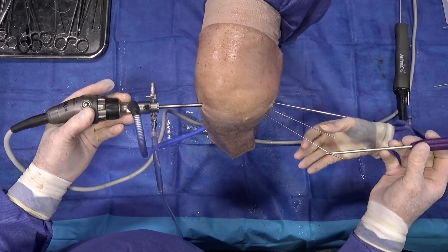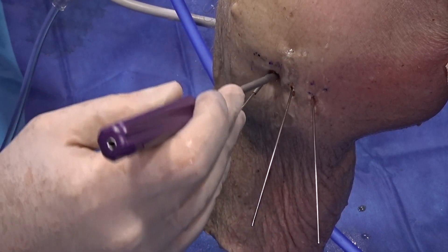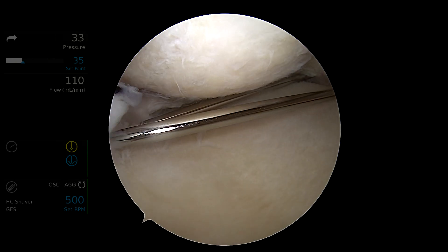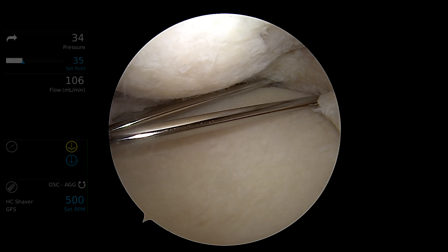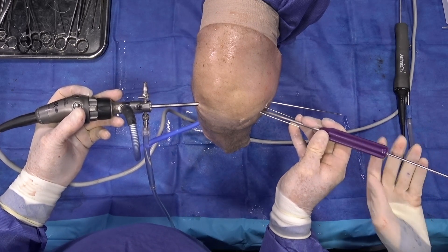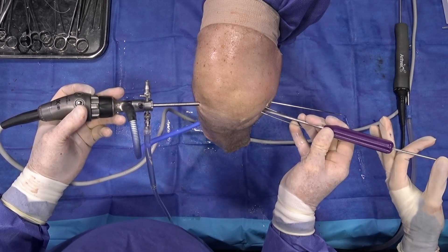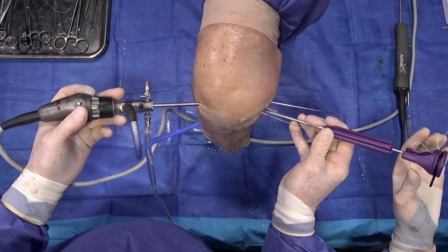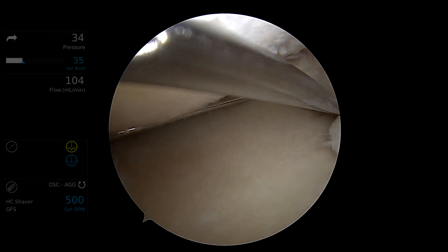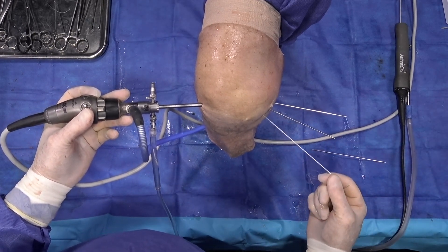The guide is placed over the guide pin, setting us at the appropriate angle to be three millimeters below the articular surface of the tibial articular cartilage. We confirm the guide wire is pointing at the tibial spine and parallel to the articular surface. The guide is advanced down to the tibial metaphysis and the assistant drills. The guide remains in place and the knotless suture tack is then placed and impacted into position. It's helpful to remove the guide pin before taking the guide out due to the divergent angle — and there we have our first anchor in position.